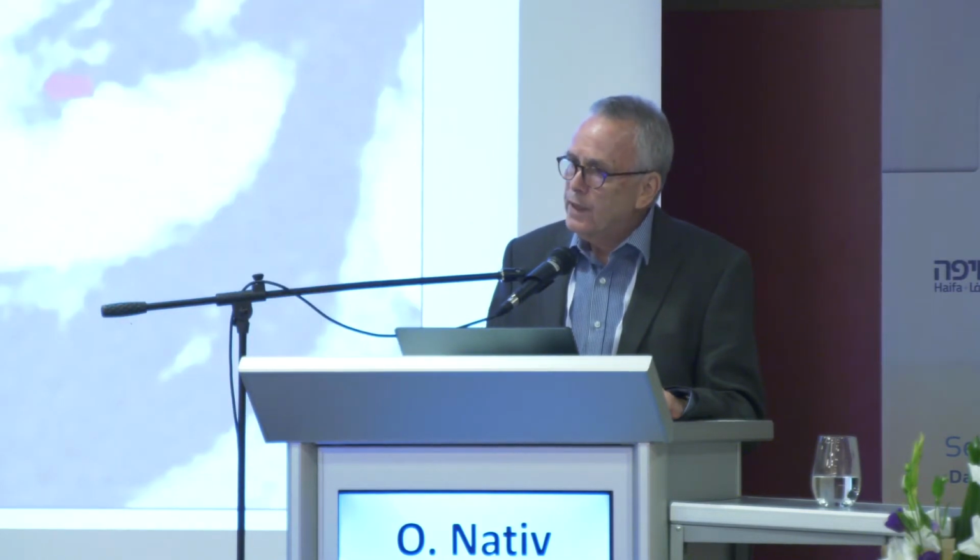We're still not doing everything. Don't get me wrong. This is a large hilar tumor on the left. This we shall not treat by cryo. On the right, you can see a tumor that penetrates into the sinus fat. This is also not adequate for this.